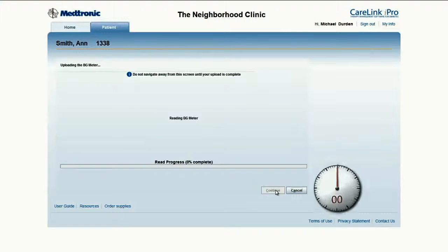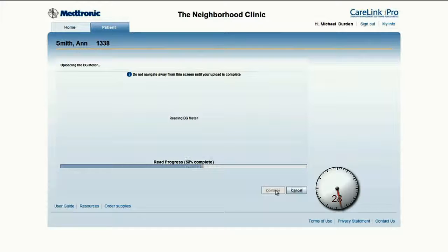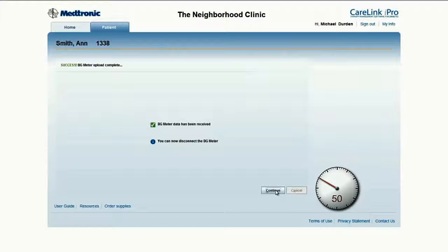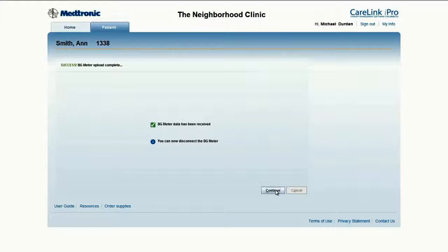The software is now communicating with and uploading the meter. A clock is included again to show how quick it is. Whether entered manually or automatically uploaded, the meter data is used to calibrate the sensor data and generate the tracings. The data is sent to the server and the transfer is complete. The meter can now be disconnected and returned to the patient if they use their own. Unlike the iPro 2 upload, the data is not erased from the meter.